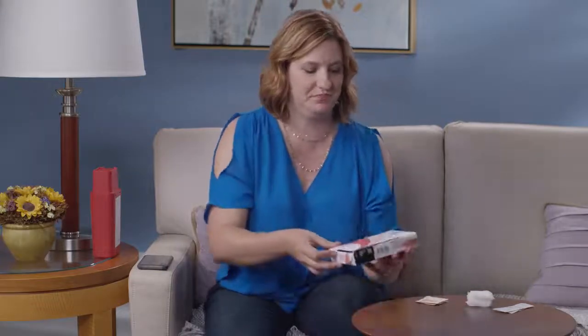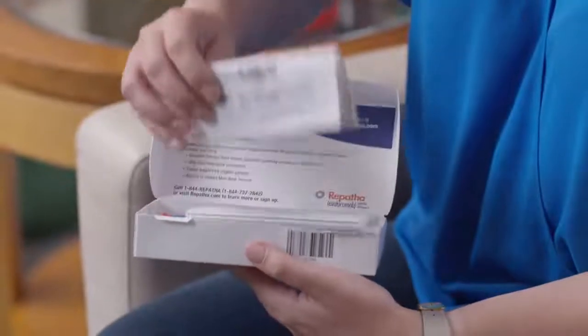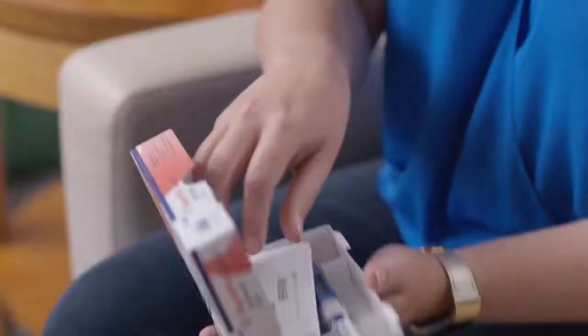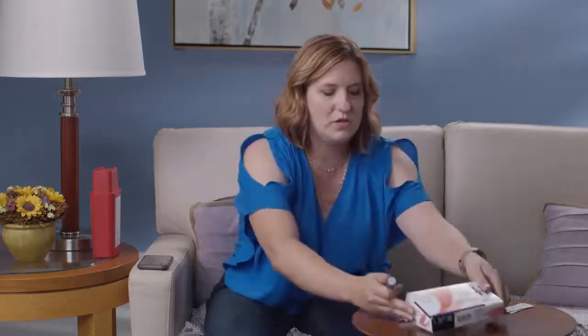Now let me show you the auto-injector. When you open the carton, you'll find that there are instructions for use right inside. You can refer to these, but today I'm going to show you. Once you remove the injector from the carton, take a look at it.